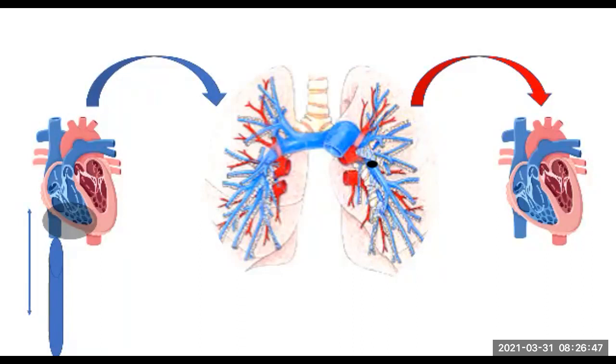Now, remember, the way that we're looking at this is sort of top down, okay? We're seeing this top down. So this is the anterior part of the chest, and this is more towards the posterior part of the chest. So as that right heart starts to dilate, what do you think is going to happen? It's going to turn the heart around in a clockwise direction. So in other words, the heart that's normally sitting here will now start with the left moving more towards the front and the right moving more towards the back as it starts to push the left out of the way, all right? So those are some of the things that we're going to see.